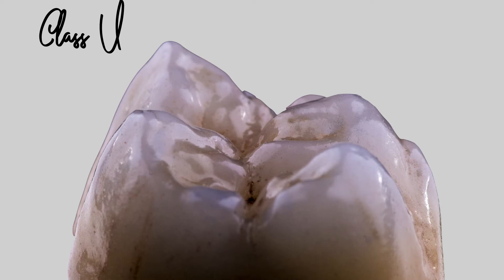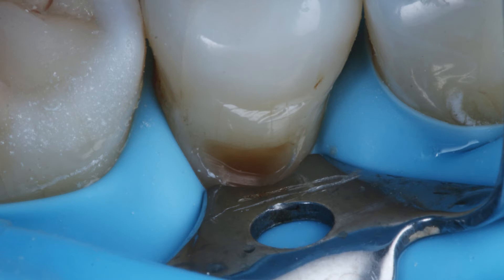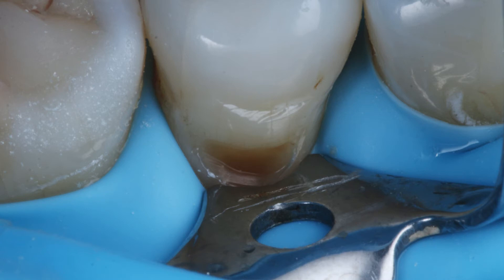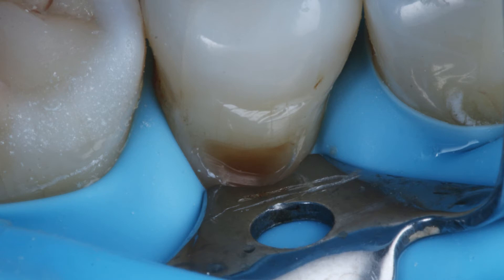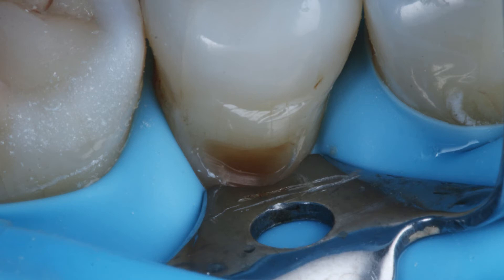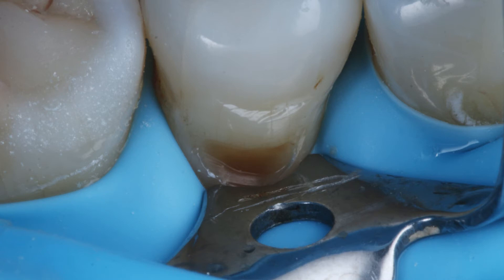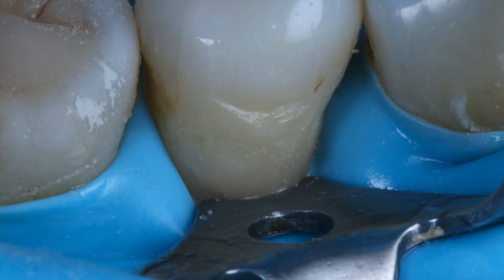Class V restorations are incredibly difficult with rubber dam. This picture demonstrates what I call slave clamping or accessory clamping: you isolate with rubber dam from, say, the seven to the one in that quadrant, and then use an additional clamp to achieve extra soft tissue and dam retraction. I prefer the B4 Brinker clamps, which work incredibly well to get that final push of the tissues and allow perfect isolation so you can build up the restoration relatively stress-free.